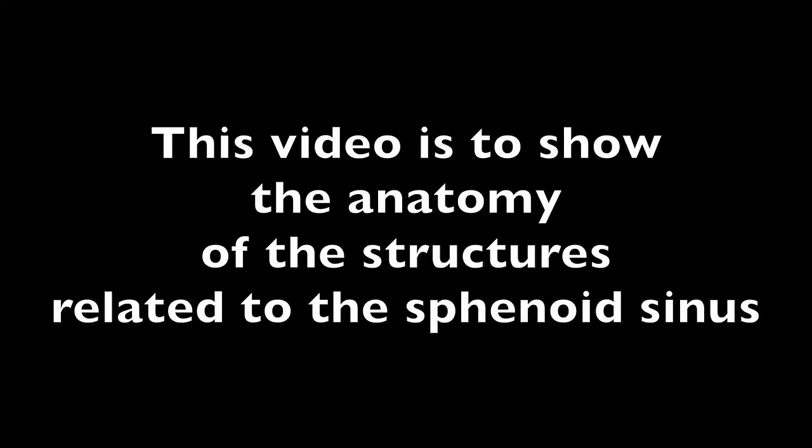63-year-old female presented with history of headache and diminishing vision. She was not a diabetic. This video is to show the anatomy of the structures related to the sphenoid sinus.